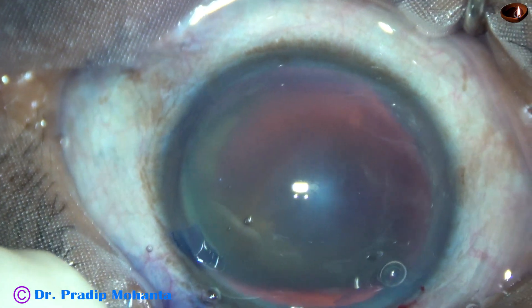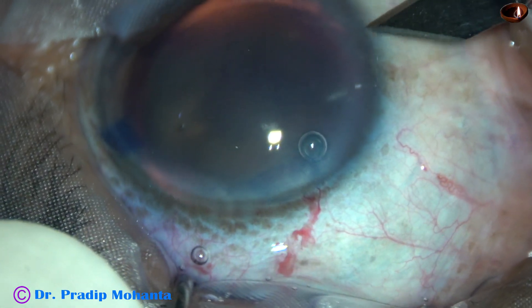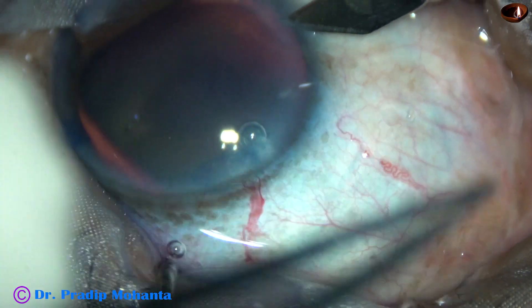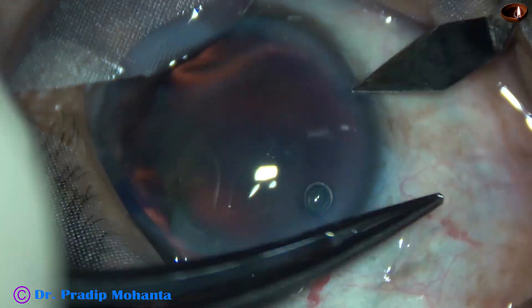A side port is made on the right side of the main wound with the keratome, because the patient has an elevated nose and the eye is deep-seated.